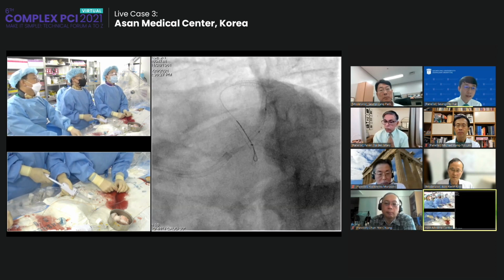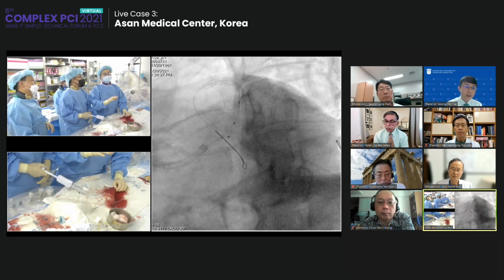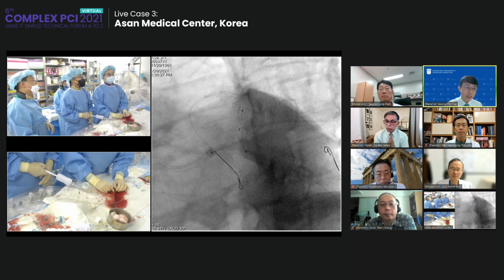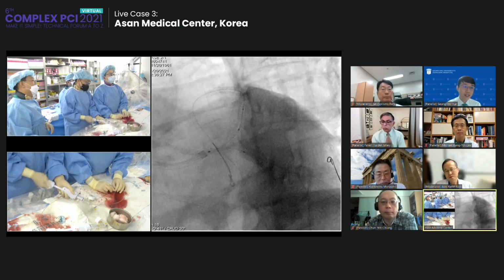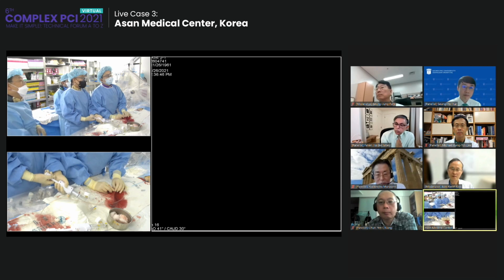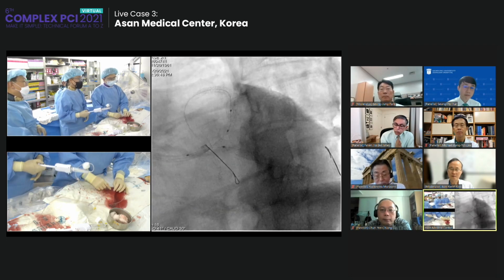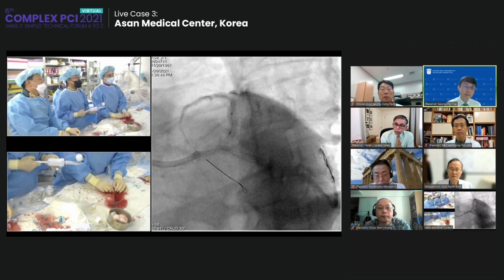Right. Left main was similar between 1 year ago and then. So 1 year ago, the patient also had disease there, but they didn't touch it. We don't exactly know, but at that time, in another hospital, I guess they didn't check the imaging or the physiology.